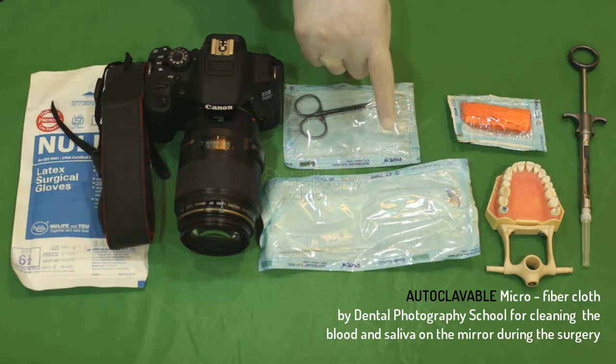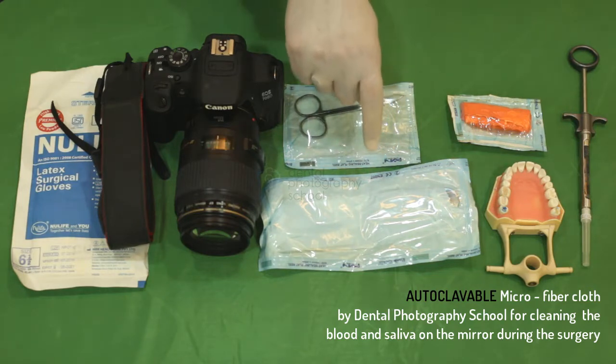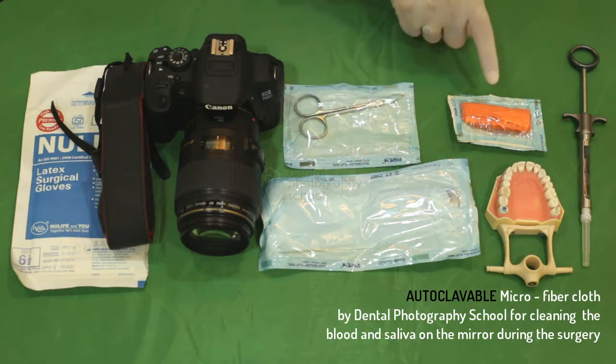You should also require a microfiber cloth. During surgeries, if your mirror gets coated with blood or saliva, you should not clean it with a gauze piece, cotton, or a tissue paper. You always have to clean it with a microfiber cloth that is autoclaved.